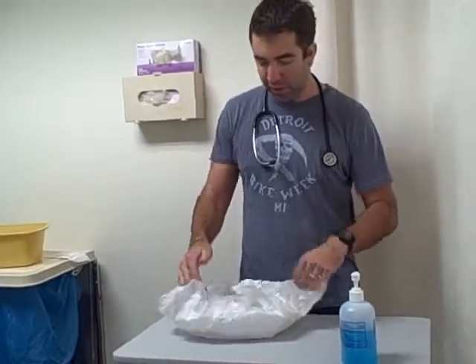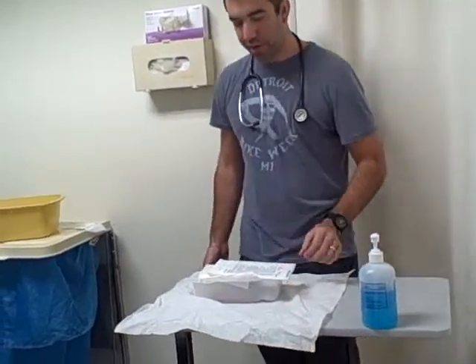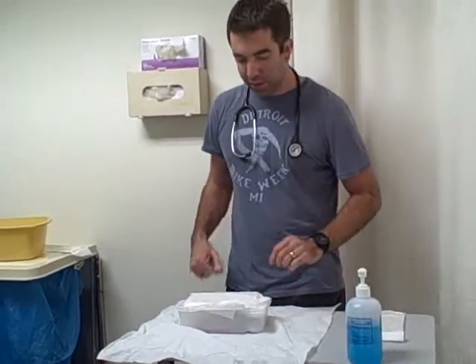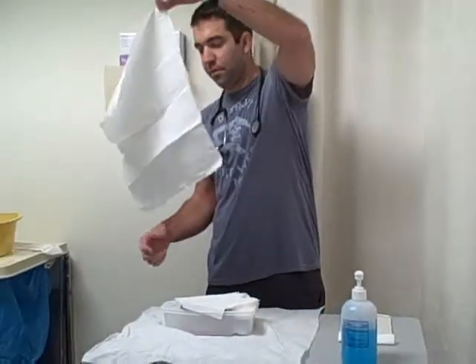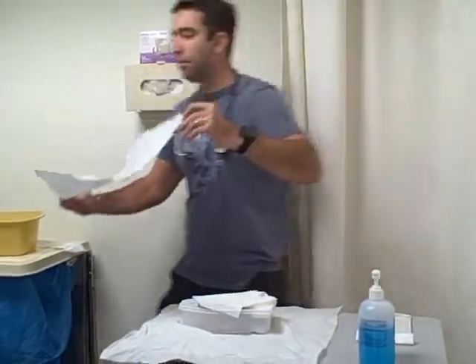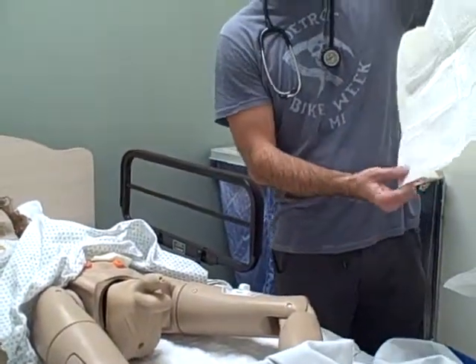Got my garbage can here, in close proximity, to throw everything away. Clean this up. Got my gloves on the top. Put those to the side for now. So I've got my sterile sheet here, and I'm gonna put this underneath the patient's butt and underneath the penis.